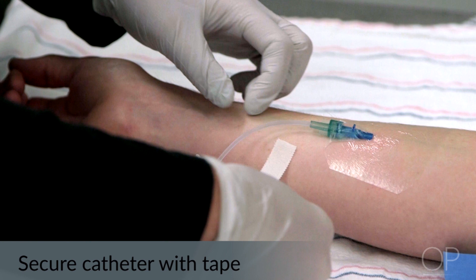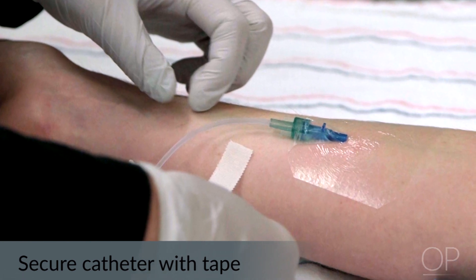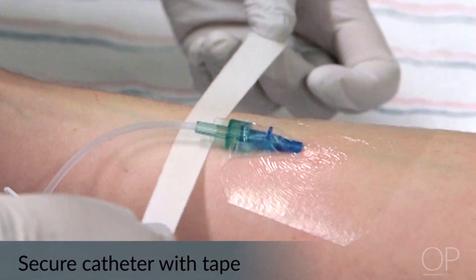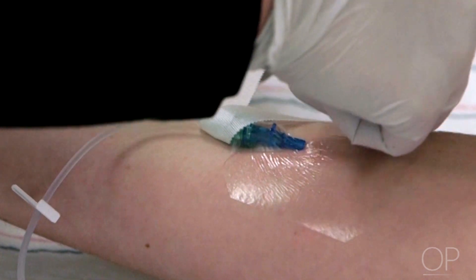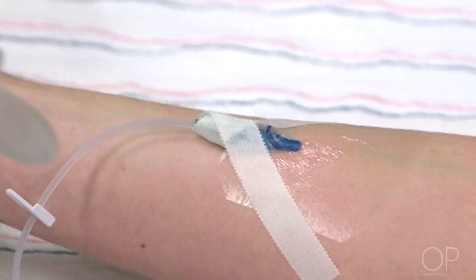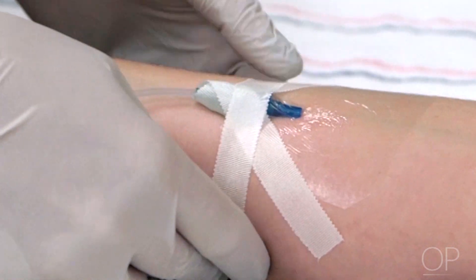Secure the catheter with tape using the chevron technique. This is shown by taking a half inch piece of tape adhesive side up, sliding it under the hub of the catheter, and crossing the tabs over one another, adhering them to the patient on opposite sides. When necessary, use a second piece of tape and secure the attachment device.